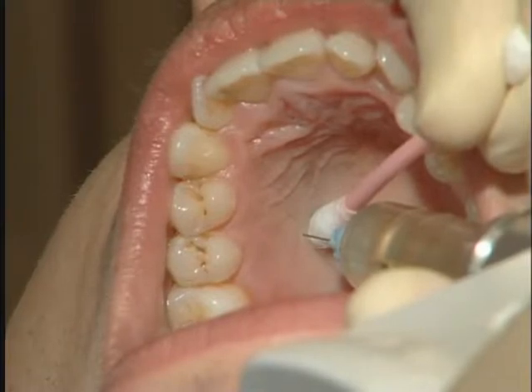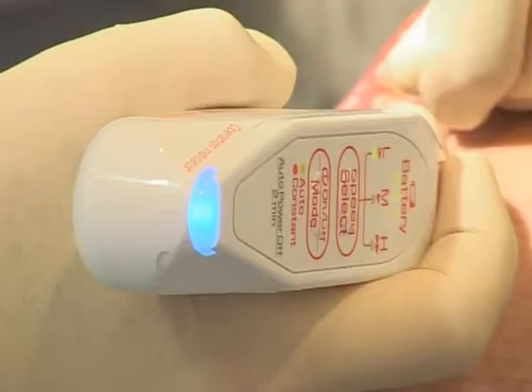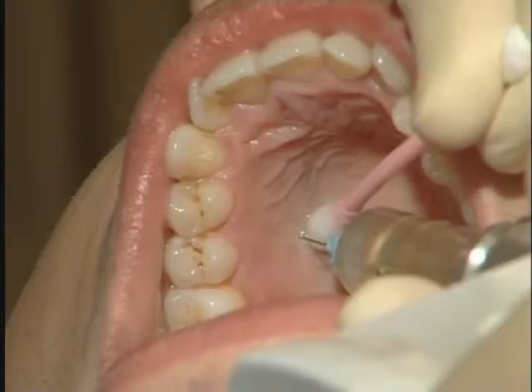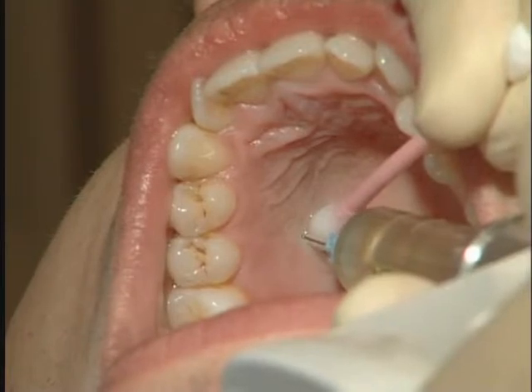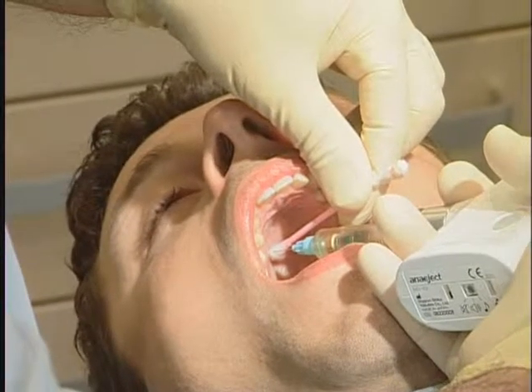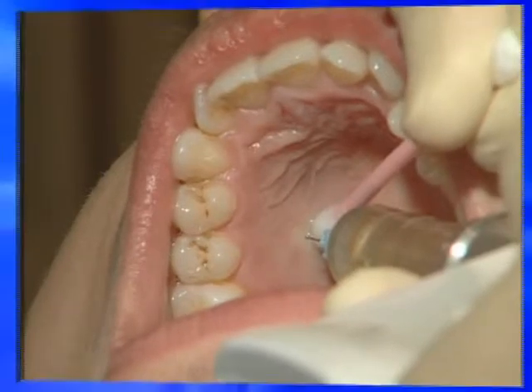This technique can be used with standard injection equipment or with automatic electronic injectors, such as Anaject, which can be programmed to control the speed of injection. With this approach, the point of penetration of the needle is located halfway between the median palatine suture and the neck of the premolars. Between 0.9 and 1.8 mL of the anesthetic solution is injected slowly, diffusing through the maxillary bone via the numerous orifices of the palatine vessels.